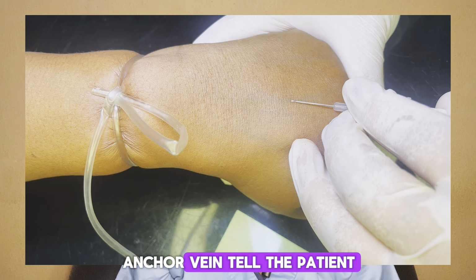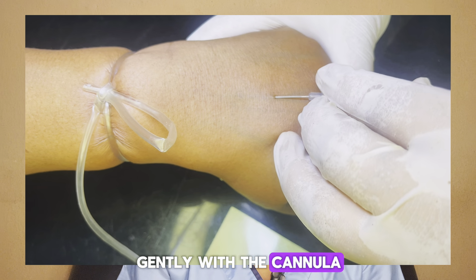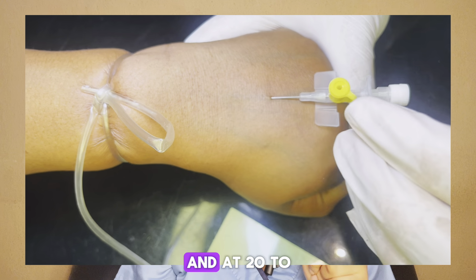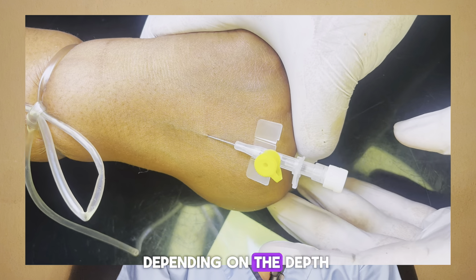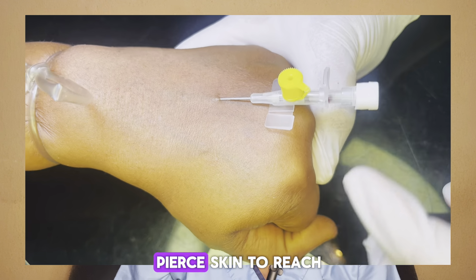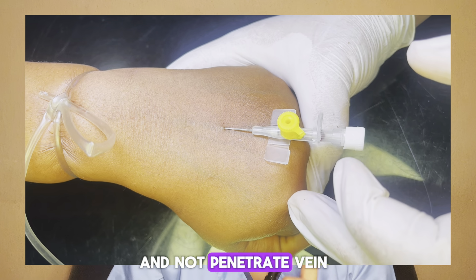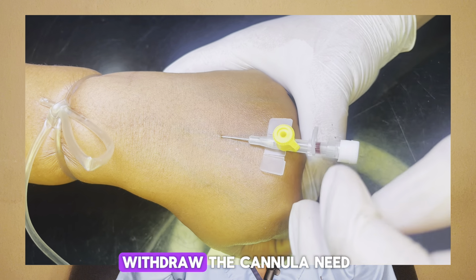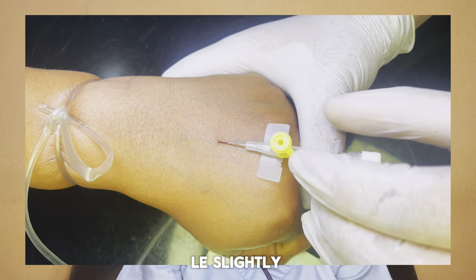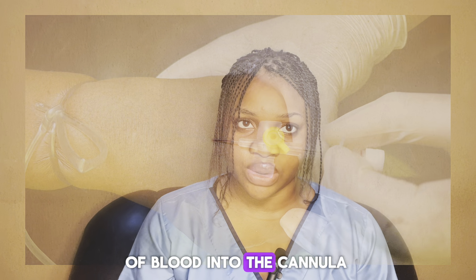Tell the patient, sharp scratch, then proceed gently with the cannula. Hold the needle up at a 20 to 45-degree angle depending on the depth of the vein. Then pierce the skin to reach and not penetrate the vein, and look for flashback of blood into the cannula. Withdraw the cannula needle slightly and look for backflow of blood into the cannula.